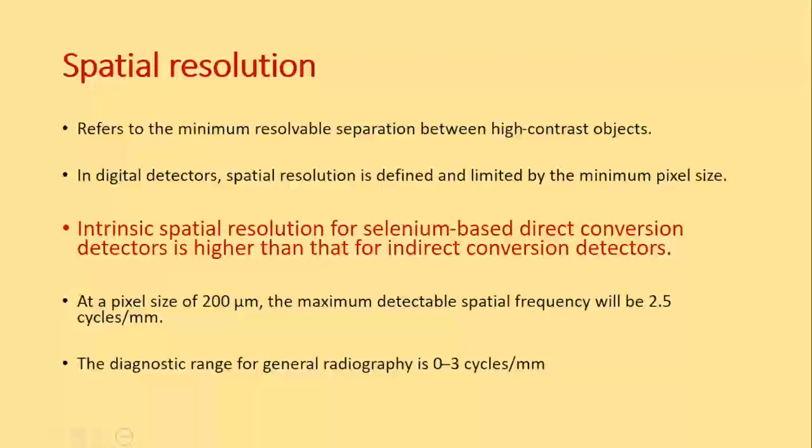And how about the well-known, renowned CT that we all use? CT scans have been used for about 4 decades now. The CT scan is roughly like the pan, 8 to 10 line pairs, but mind you, 8 to 10 line pairs per centimeter. So it's not mm, it's a centimeter.